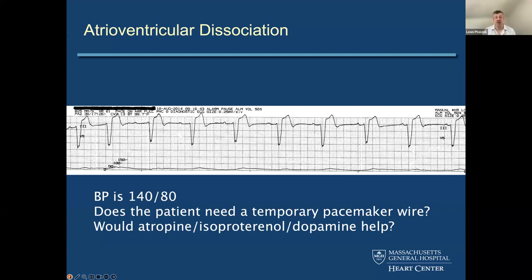Yeah, I didn't mention it at all, but I should have. The standard is that if you have access to a temporary pacing wire, an endovascular system, that's what you should use because it's the most reliable and less painful than the transcutaneous. But you use whatever you have, and if it happens to be transcutaneous pacing, then so be it. It's certainly one of the things that you have to have available. Can you go over the settings? What recommended rate and current output would you use? Because they're not 100% sure about this.